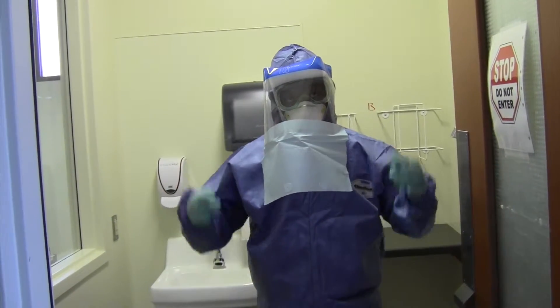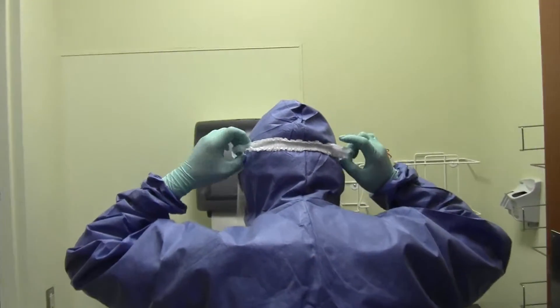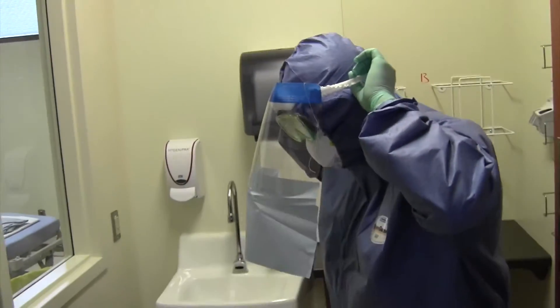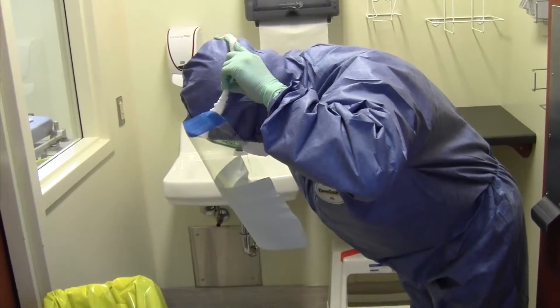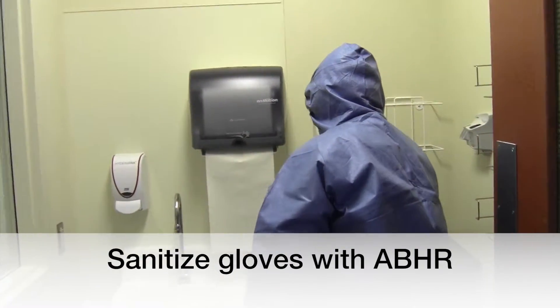Step 5: Remove full face shield. To remove the full face shield, grasp the strap from the back, then bend at the waist keeping your back straight and your chin extended. Pull away carefully and over the face in a smooth, controlled motion. Sanitize gloves with alcohol-based hand rub.